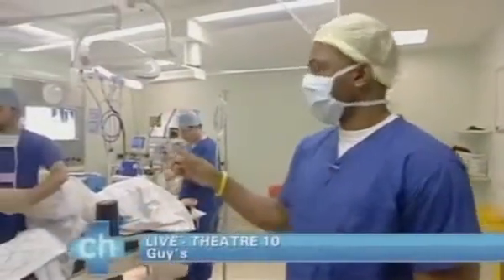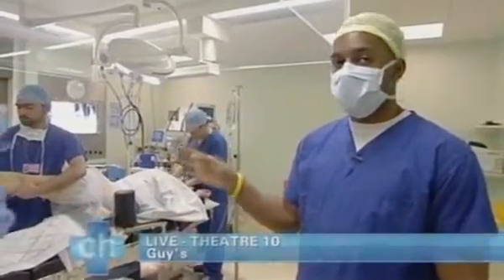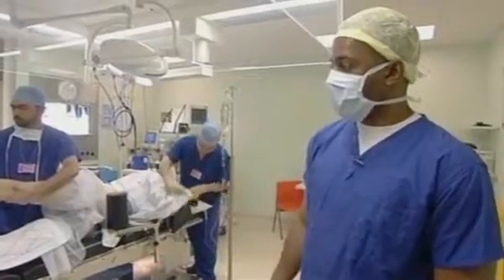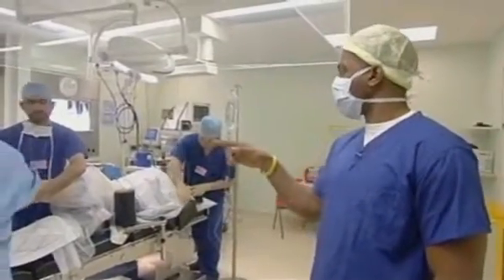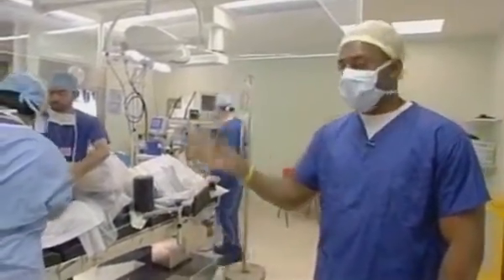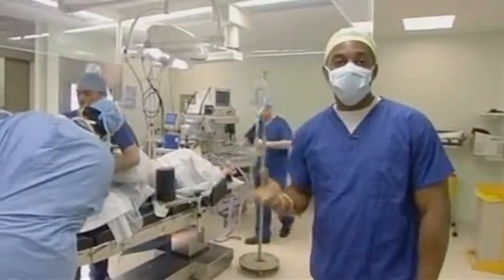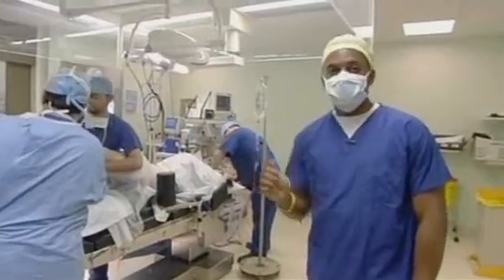In theatre here, you can have a look now. Steve is our patient who is having an operation on his ankle. At the moment, as you can see, the team are just preparing, I think that's an iodine solution, isn't it? Yeah, an iodine solution which makes the whole part of the ankle clean. Now, it's a common sporting injury that happens to most people, of course, a sprained ankle. But for Steve, it was happening all too often.